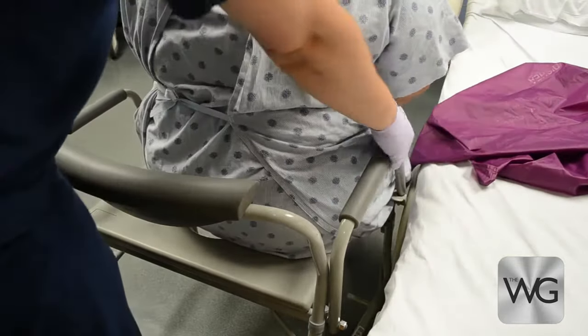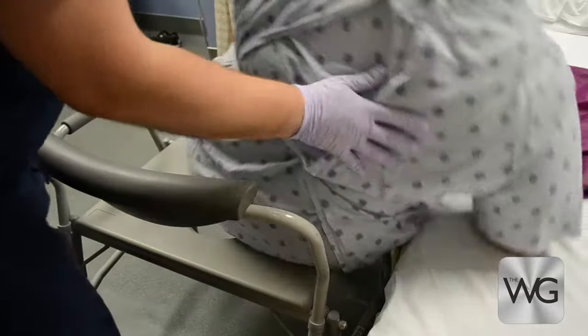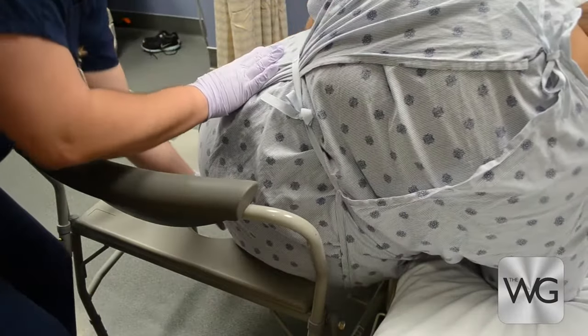When working with a patient of size, the caregiver may remove the side rail and instruct the patient to lean onto the mattress to gain better access for cleaning.